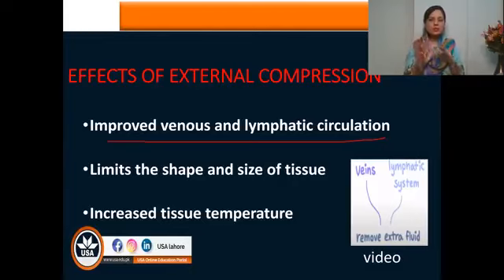This is somehow different for you, so I'll explain this one later on. And the third one is increased tissue temperature. By using the external pressure, we can increase the tissue temperature, so we may get certain effects that we want by increasing the tissue temperature.